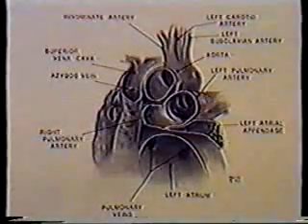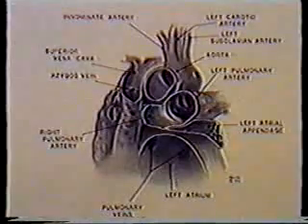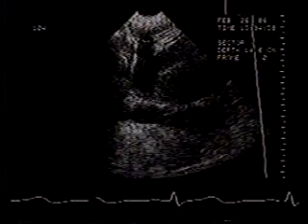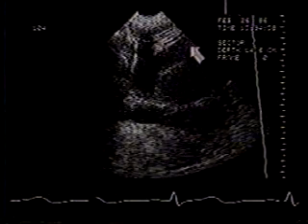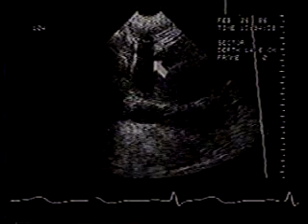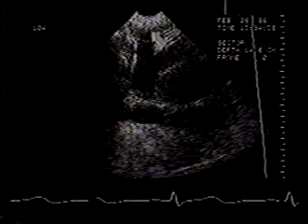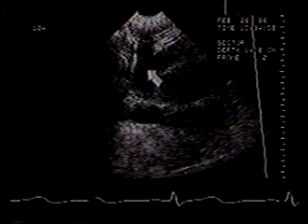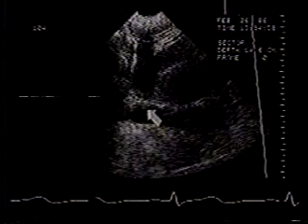The superior vena cava can be investigated by moving the transducer to the right supraclavicular position. In this still frame, the aortic arch in short axis is not completely in focus. The left brachiocephalic vein crosses over the arch. The right brachiocephalic vein is formed here at the junction of the subclavian and jugular veins. The two brachiocephalic veins converge and form the superior vena cava, which is here seen in long axis to the point where it crosses the right pulmonary artery.